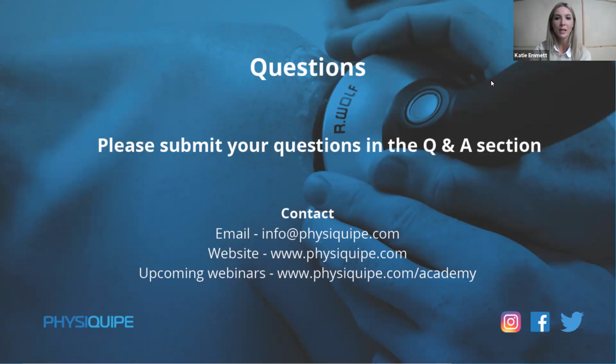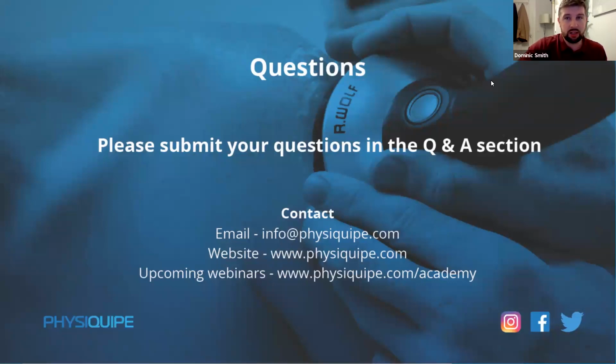A question from Michael: in your opinion, can radial shockwave be used for pregnancy patients, even if it's used away from the abdominal area, for example on the upper limb? This is a controversial area. Obviously, if it's away from that area, some people will argue that it's okay. I have always erred on the side of caution. If I can find an alternative in terms of exercise rehabilitation, stretches, and other treatments, I will. I just don't want to risk it.